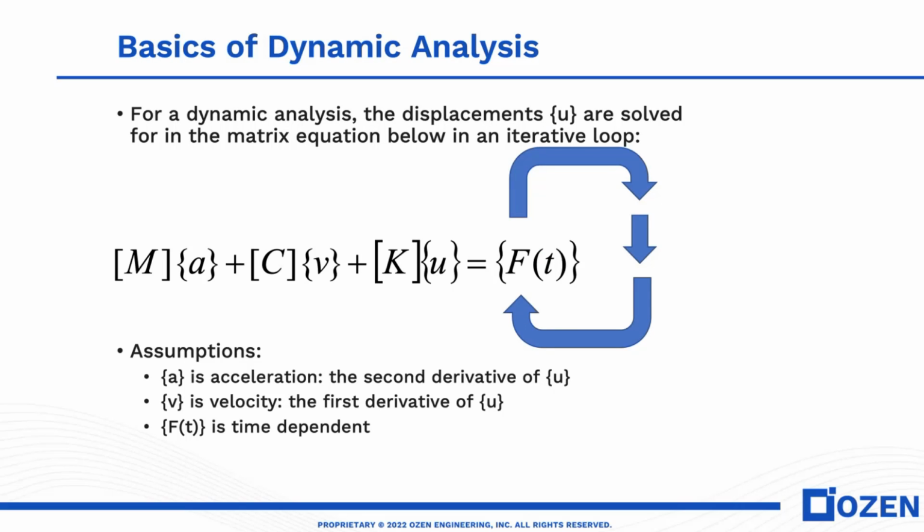And if we are doing a dynamic analysis, the dynamic analysis can be a linear dynamic or nonlinear dynamic analysis. In either case, in a dynamic analysis, these sets of equations are being solved over a time domain. And for each time increment, if it's a nonlinear dynamic analysis, you're going to do multiple iterations to get convergence.